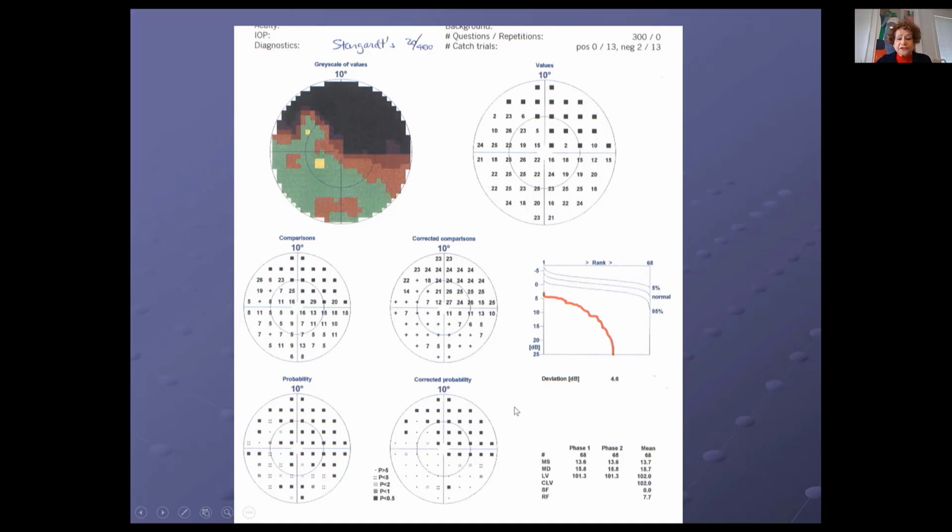So again, these patients will have paracentral field loss. So if you have a patient who may not have been diagnosed with a macular dystrophy, an inherited macular dystrophy, who is a glaucoma suspect, let's say they have high eye pressures, and you do a visual field and find on your central field that they have a paracentral field defect, look to see where they are fixating. Because what they do is they fixate superiorly and the lesion is inferior to fixation, which projects to a superior field loss.